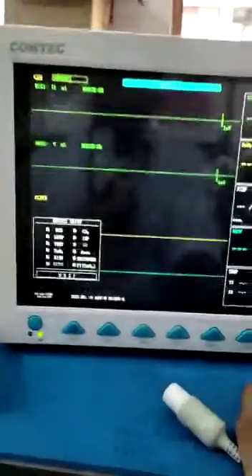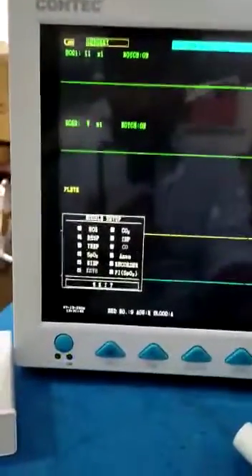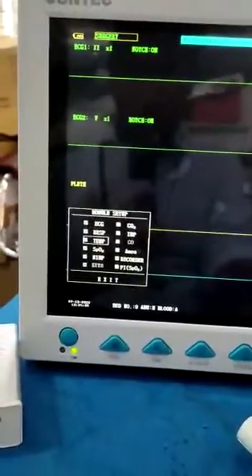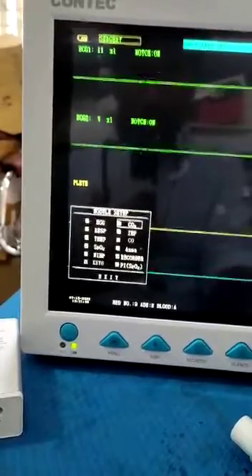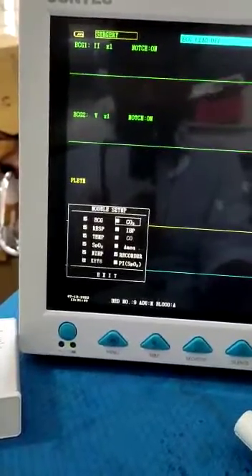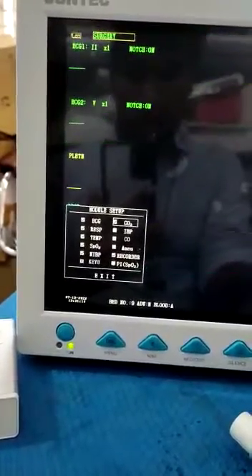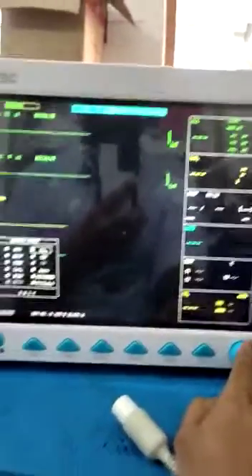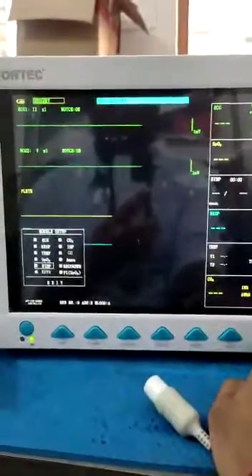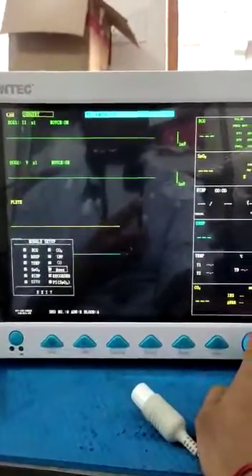In Module Setup, you have to activate CO2. You can see here — CO2 is now activated. Then go back.